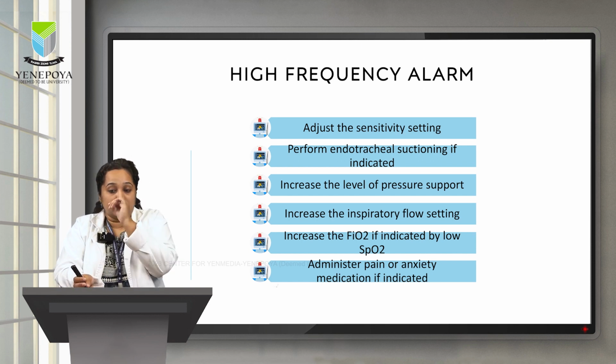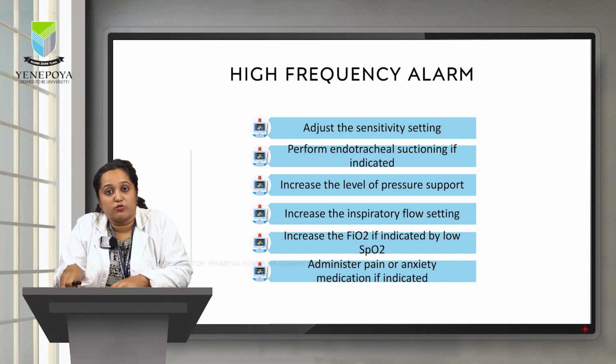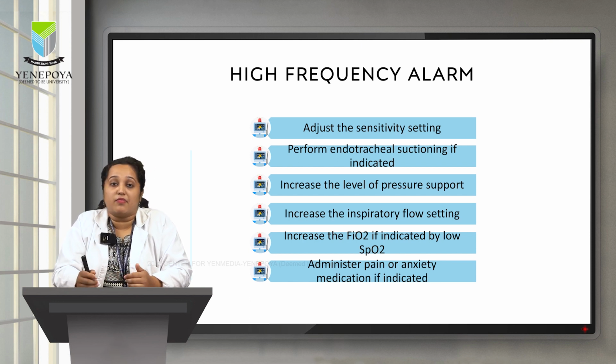Usually what will happen in a case scenario like you are trying to wean a patient and you have put the patient on pressure support mode of ventilation. Now what is going to happen is you have not given adequate pressure support for this patient and the patient is fatigued by breathing on their own. Soon he is going to be in tachypnea and he is going to start sweating so much and you will get all sorts of alarms. Also your patient will be completely agitated.